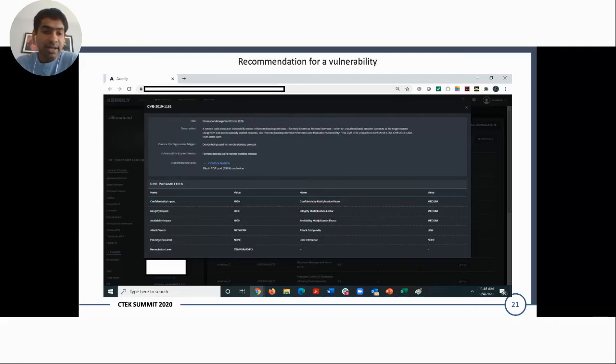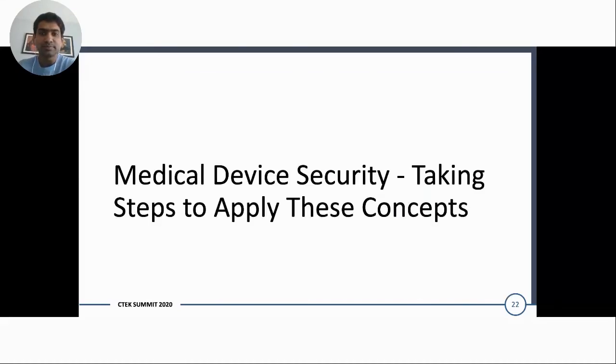And then you're coming up with a list of CVE parameters that is effectively telling you what is the priority, and then the mitigation tells you how you really want to focus. So this is a way to actually help you manage your vulnerability and focus on a critical few. So to mitigate your costs while reducing decommissioning costs, mitigating risk while reducing decommissioning costs, so you can continue to use your devices while lowering risk. Okay, Carrie, back to you.